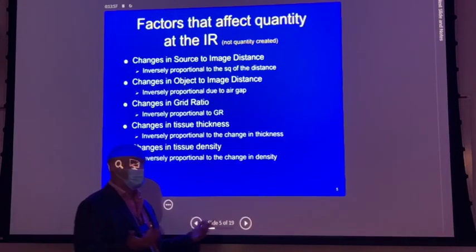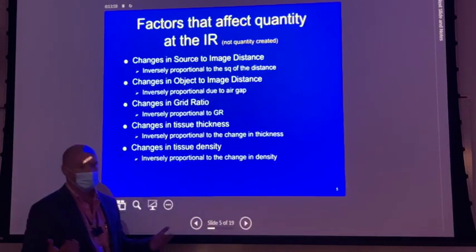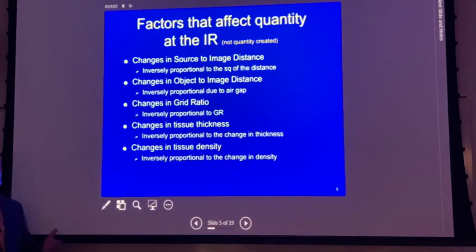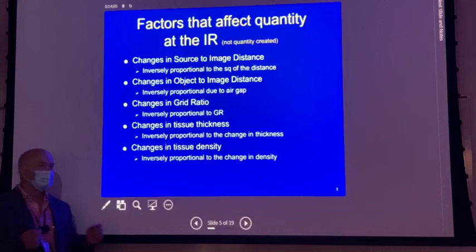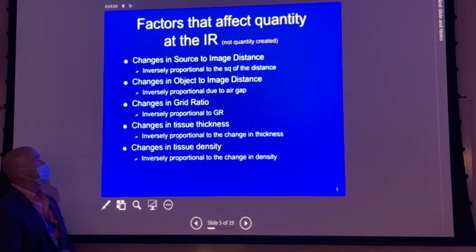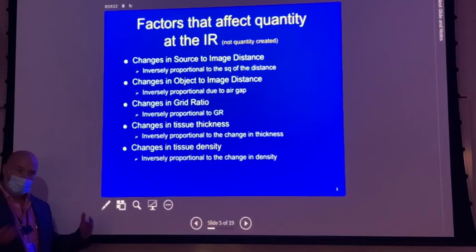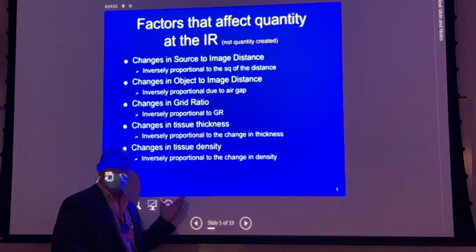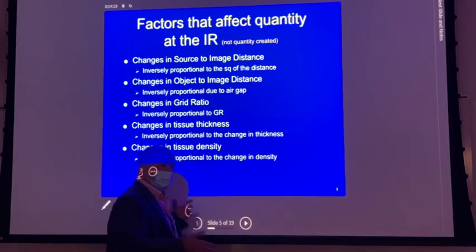The air gap, I always thought it was pretty hokey. You could see gross anatomy, but as far as fine detail and really high contrast, you'd have to decrease your kVp significantly. But the theory behind the air gap is that it works like a low ratio grid because the wide angle scatter radiation is going to miss your image receptor.